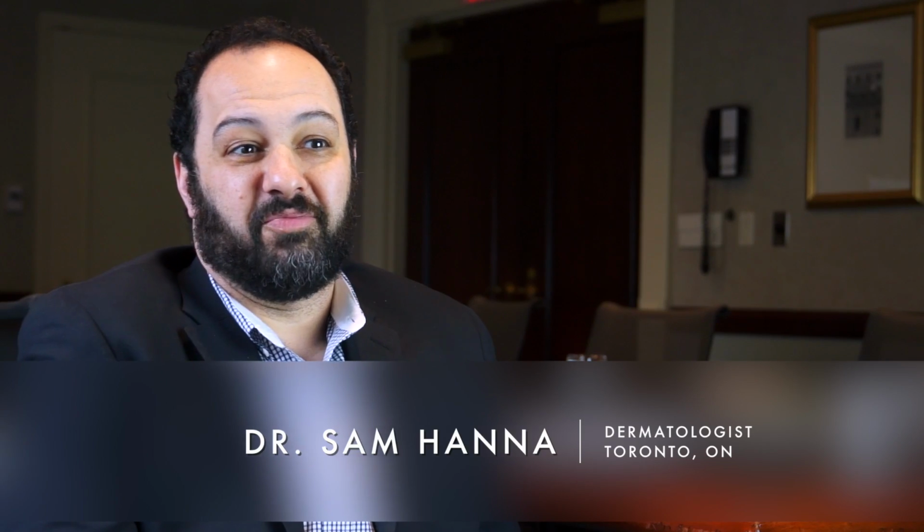It does this in a way that's not particularly pro-inflammatory, which is important. So again, the modifications that they made to the Dextran allowed low inflammation, but with the stimulation of collagen. Of course, that's one of the major structural components in our skin. So when you turn up the volume on synthesis, on production of collagen, you get a nice natural result in terms of filling that's quite durable.